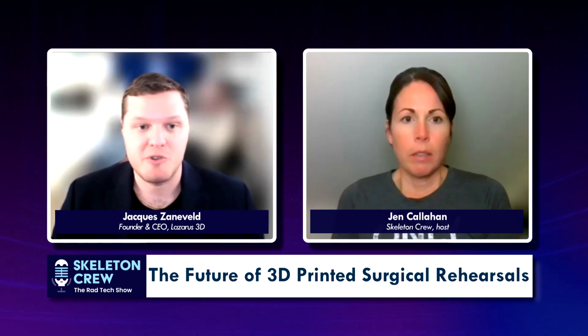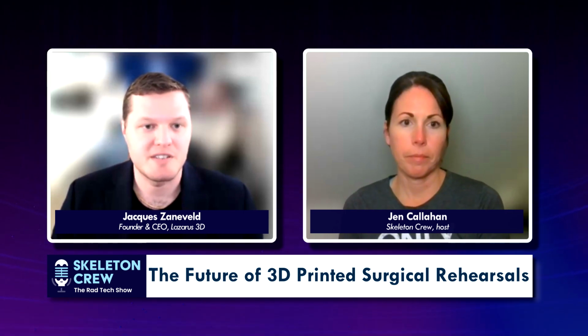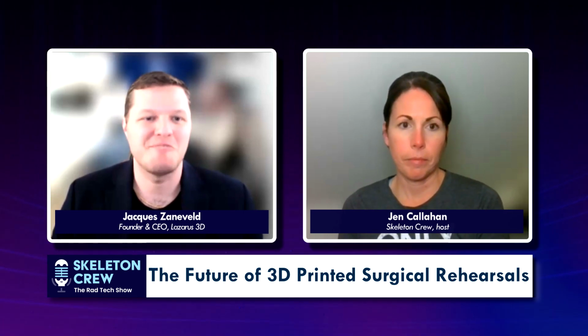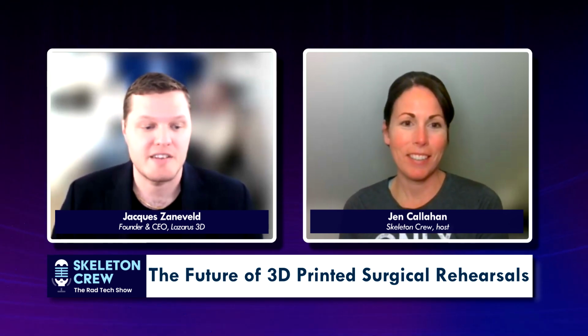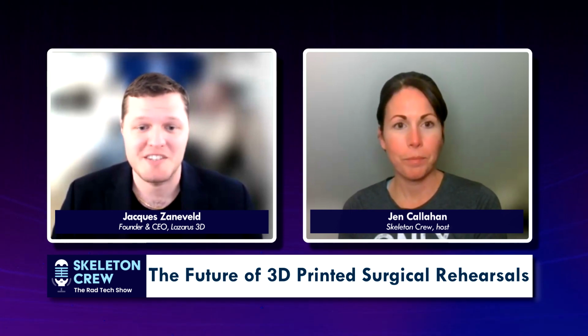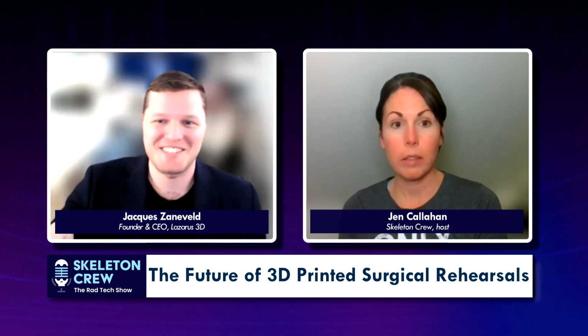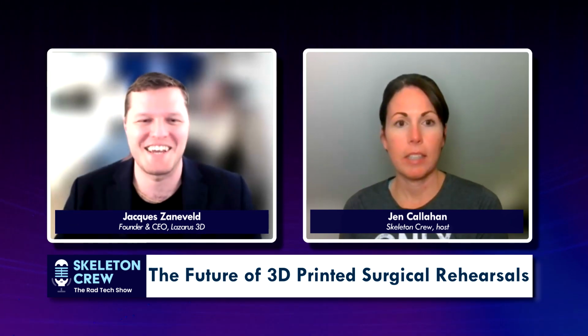Well, and that's what 3D printing is, right? It's rapid prototyping. So what our technology allows us to do is within days take in any shape from any scan and build it. The turnaround times are insane. I think the shortest we did was for a kidney cancer application, and it was 16 hours between the physician handing me a CD with the data and us handing them the organ the next day.